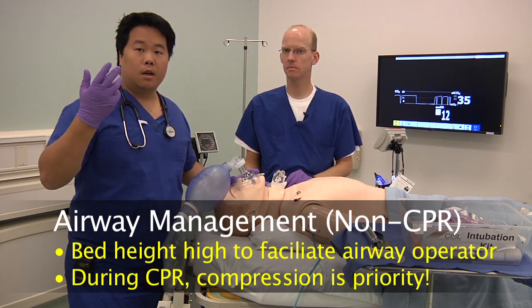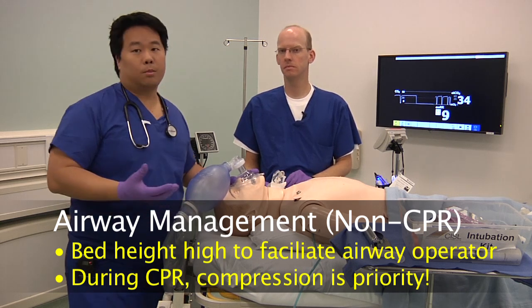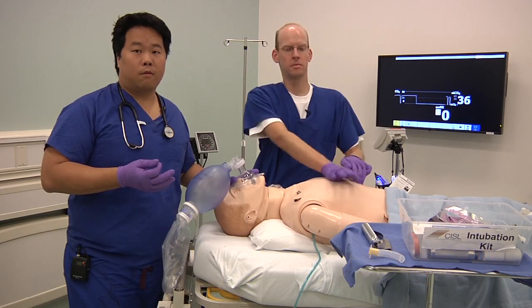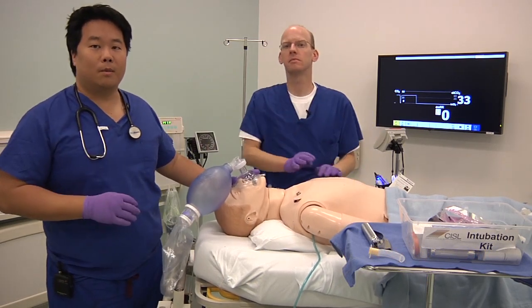Obviously, if you're in a code situation, compression takes the priority, and the bed has to be much lower in order to facilitate the compressor performing chest compressions. As you can see Kyle demonstrating here, that's really not possible when the bed is this high.